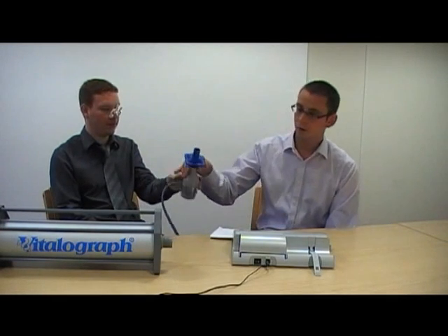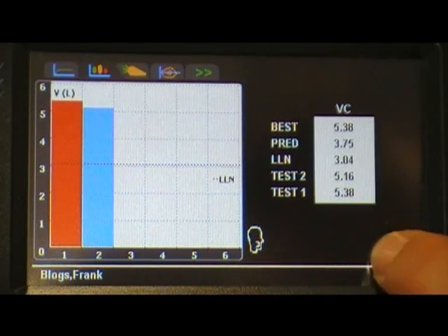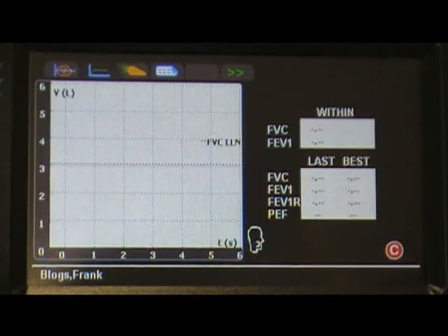Once you have two good blows, you can exit from the Vital Capacity screen by pressing the C icon in the bottom right-hand corner of the screen. This will automatically take you to the Force Vital Capacity testing screen.